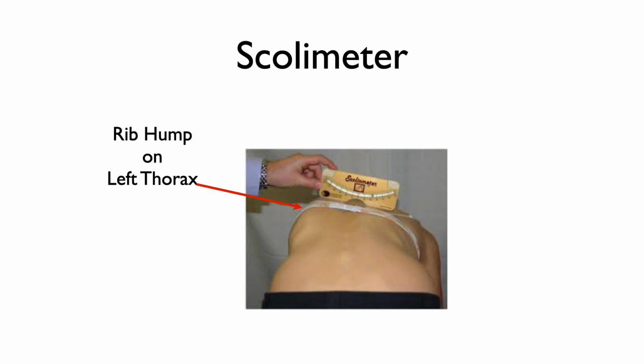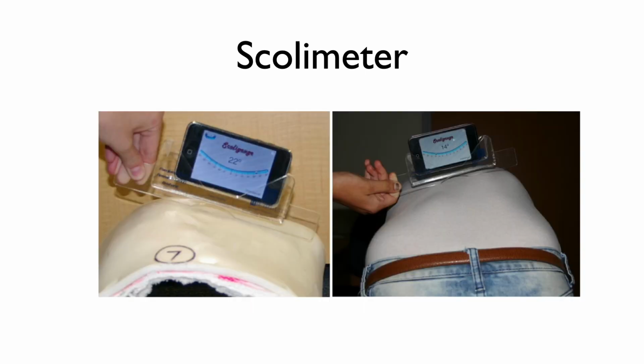These can be a useful tool to track changes in curve rotation without multiple x-rays. A lot of my older clients don't like having multiple x-rays, and they're more focused on the aesthetics of their spine. So this is a great tool to notice any changes in the rotation. You can even use your smartphone with these as well.